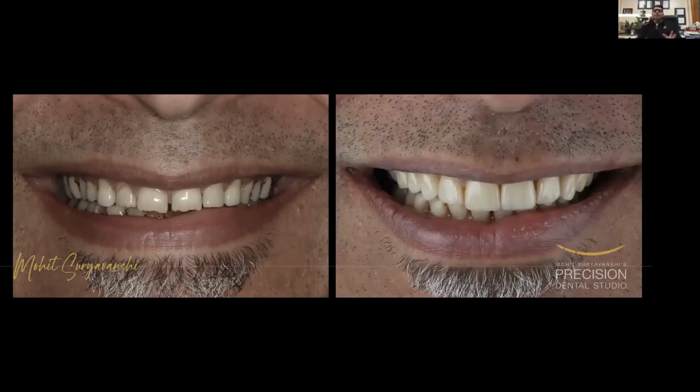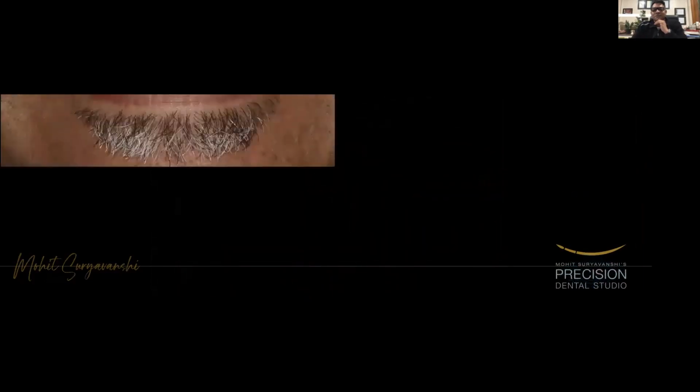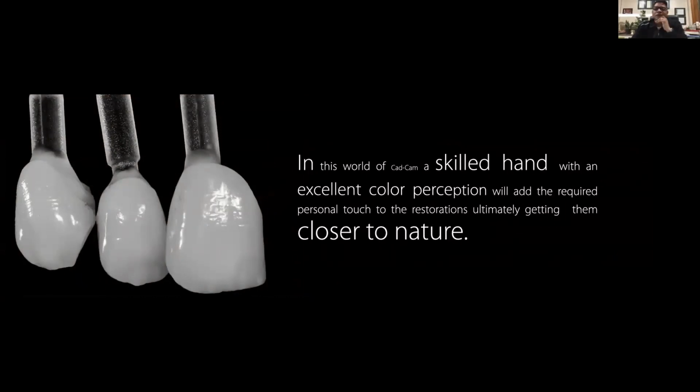We did not give him very white looking and rounded teeth. Whatever we gave him was absolutely suiting his personality and his lifestyle. So it was absolutely as good as invisible. And that's the role of a dental technician. So in this world of CAD/CAM, a skilled hand with an excellent color perception will add the required personal touch to the restorations, okay? Ultimately getting them closer to nature. So shape and color, you need to have the right information, you need to have the right study.